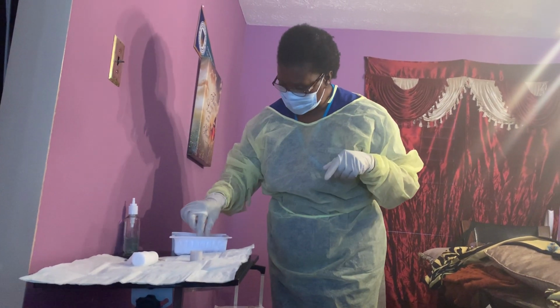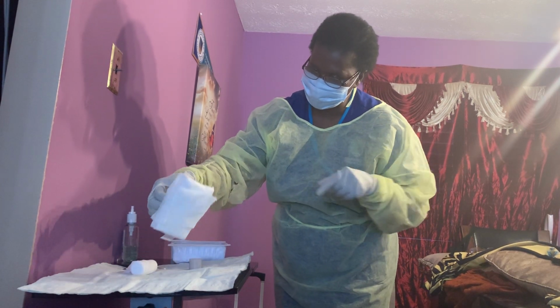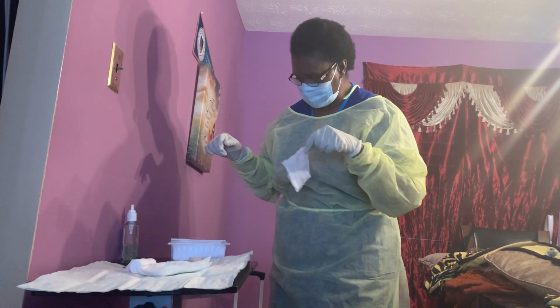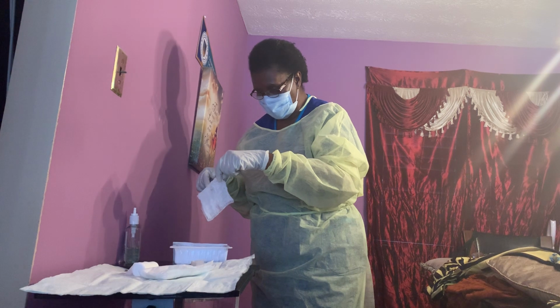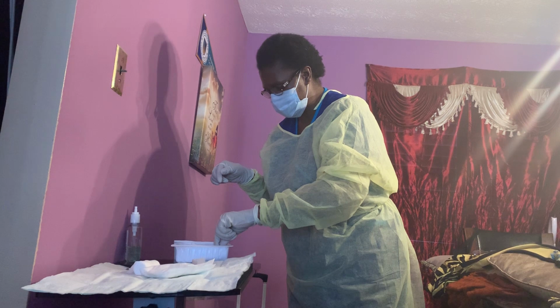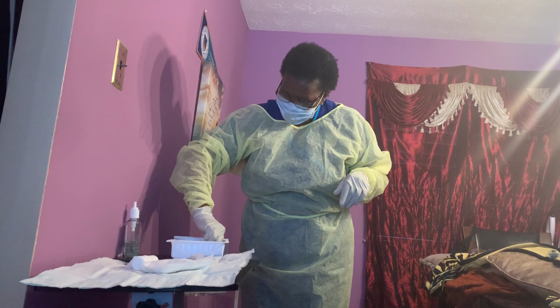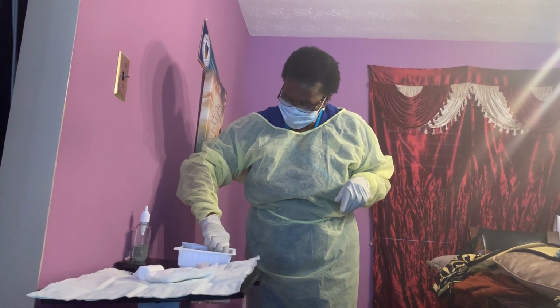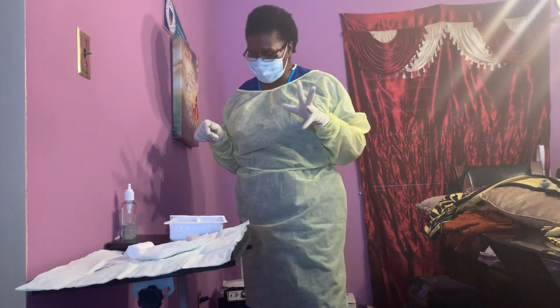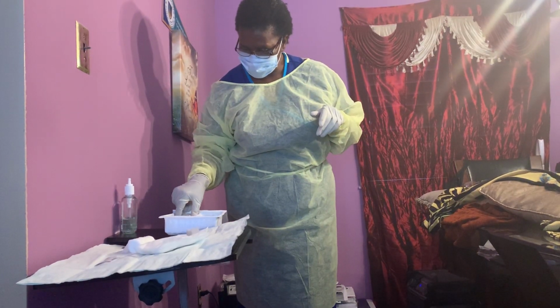And then I'm gonna do the pad and any gauze that comes with it. Hand is still sterile, so I put the absorbent pad there. And the sterile gauze, I want to still leave it inside. My gloves are still sterile, so I want to leave it in there. I don't want to take it out. Then I'm gonna take my sticker. Oh, excuse me. My labeling sticker out. So now that is done, I have my normal saline here.